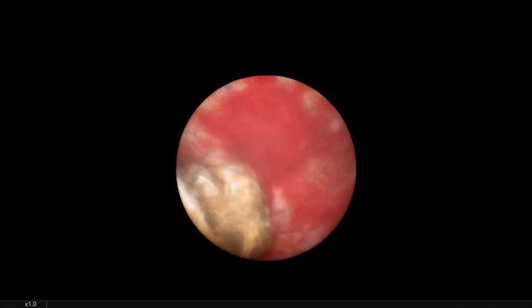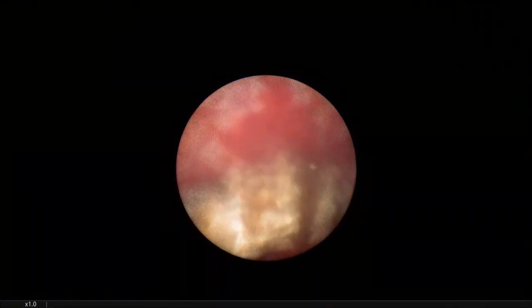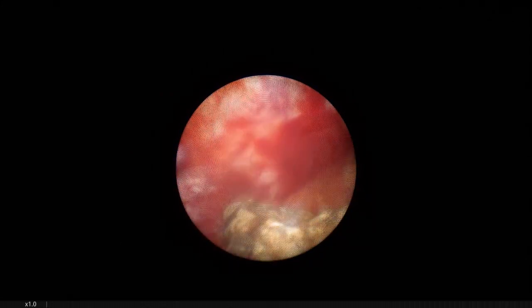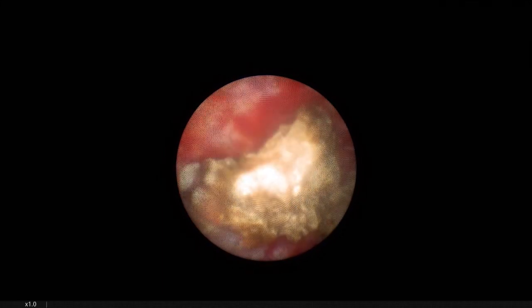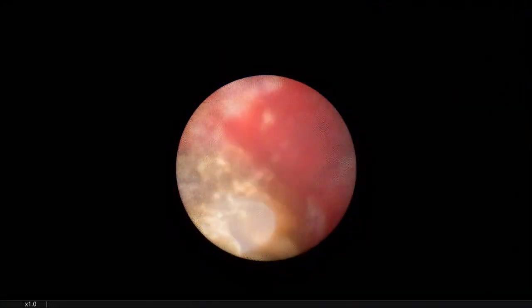You never use any forceps? No. Because stones come automatically to my Amplatz sheath if they are small enough. If they are small enough, they will come inside. And you can see the very small and tiny fragments. They look like snow. They come automatically to the Amplatz sheath. They migrate through the Amplatz sheath like sand.